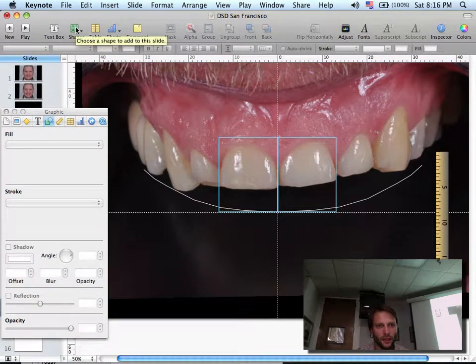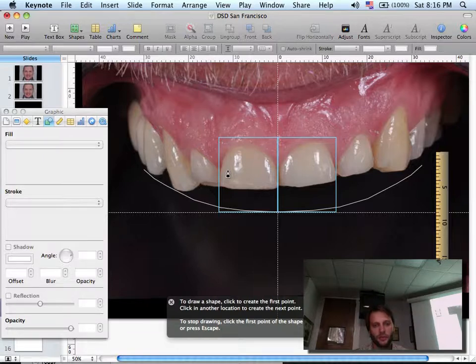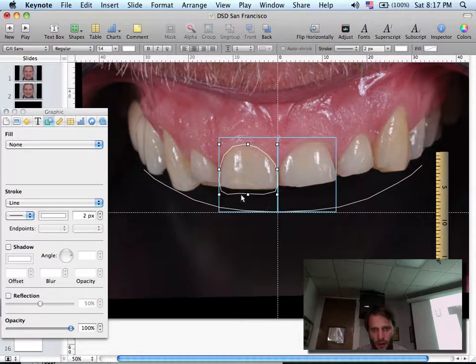So we can click and activate my pencil, and my suggestion is for you to draw on top of the existing tooth as a reference. Maybe already making it a little longer, just to guide us through the process. And then you can stretch. So it's easier. And then you can fix little by little.